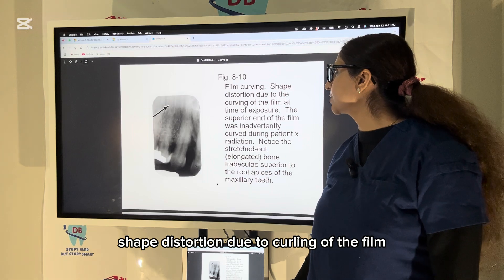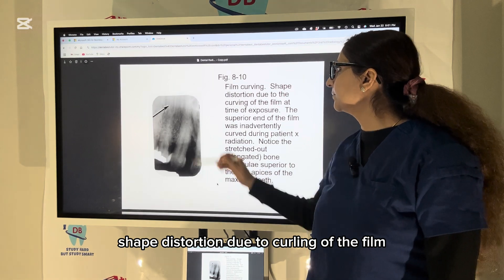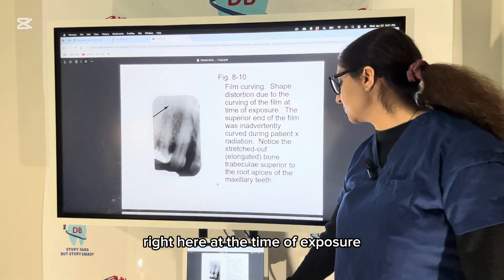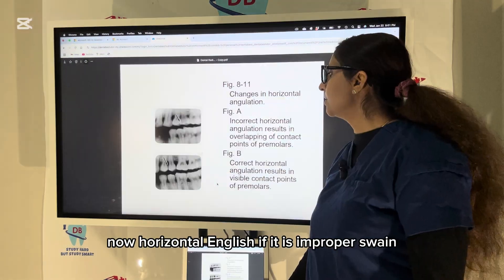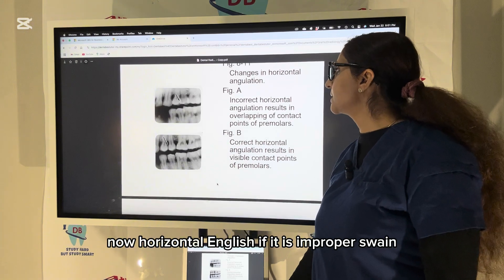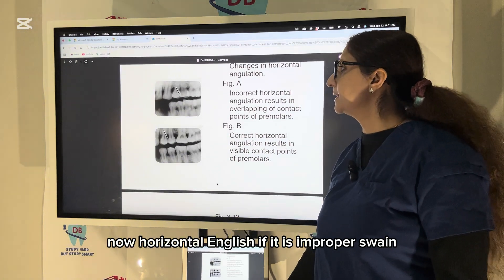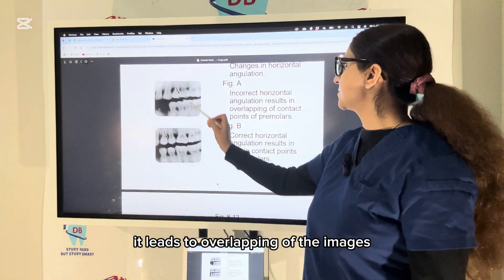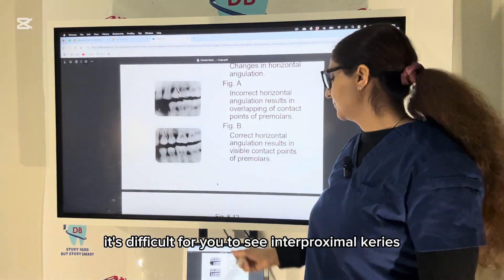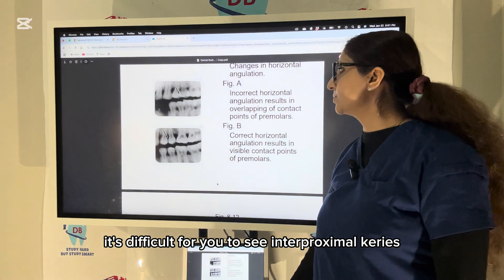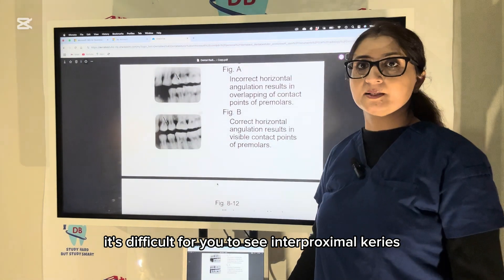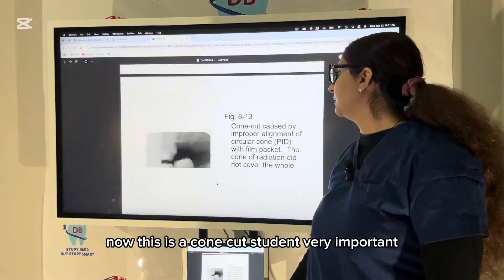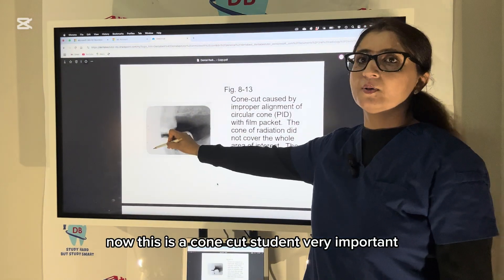This is film-curving shape distortion due to curving of the film at the time of exposure. Improper horizontal angulation leads to overlapping of images — it becomes difficult to see interproximal caries when there is overlapping.